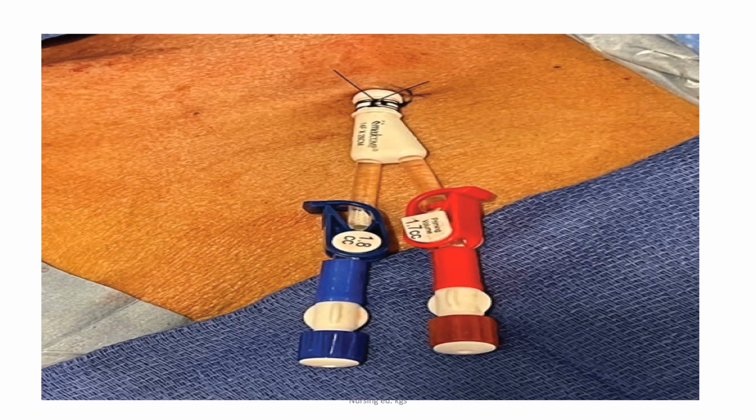And this is an example of a tunneled hemodialysis catheter. When it comes to care and maintenance for these specific catheters, there will normally be orders from nephrology. And as I mentioned before, the red catheter is normally to remove the blood from the body for dialysis, and then the blue returns it.